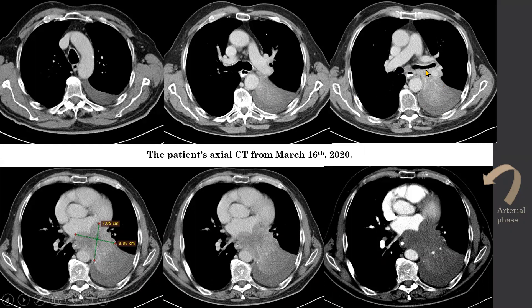Importantly, in the coronal images, a secondary bronchial branch is missing on the left side, which relates to the mass causing an obstruction leading to the atelectasis. The mass dimensions are visible, and you can see its relationship to the esophagus, aorta, and left atrium in both venous and arterial phase imaging, noting the regional spread to neighboring structures.